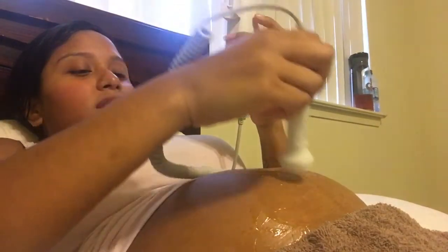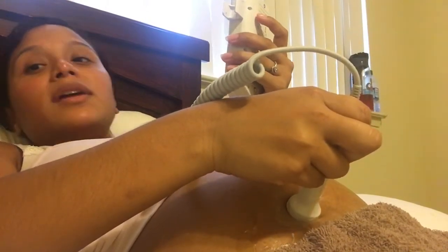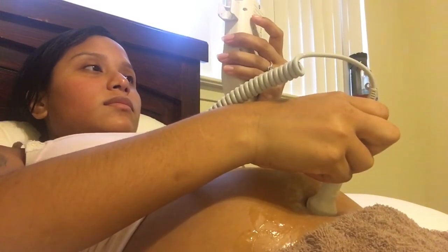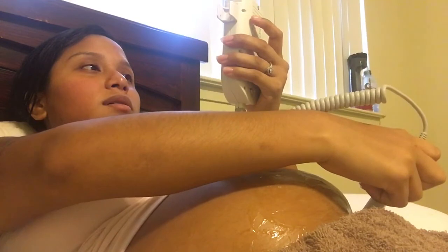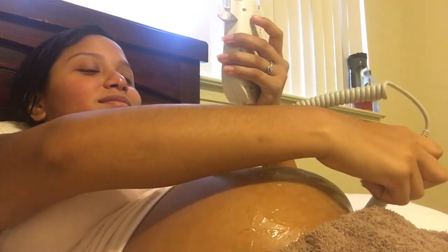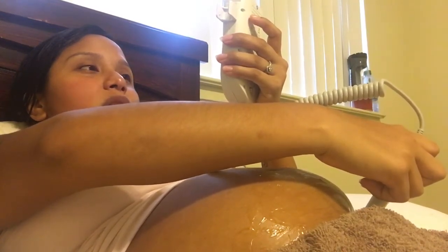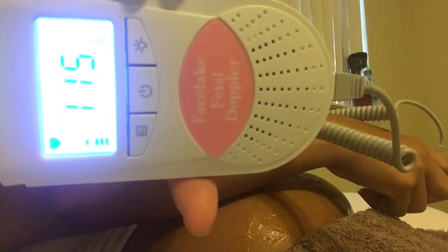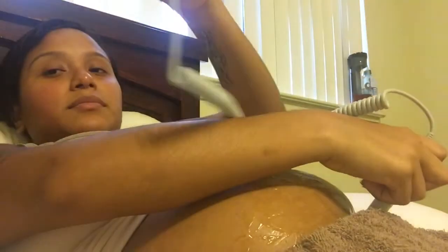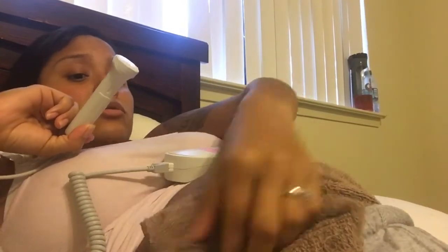That's basically it, guys. That's just what you do — that's what I usually do. She's kicking me! This is how you find her heartbeat and use the doppler. She's like the boss of my body, like 'get this off of me!' But that's her heartbeat — I love hearing it, it's so beautiful. There it is.